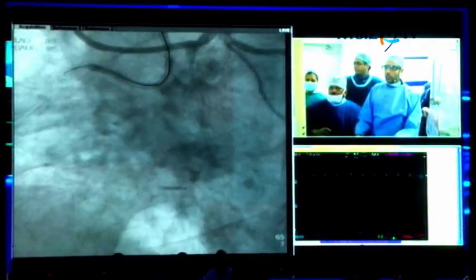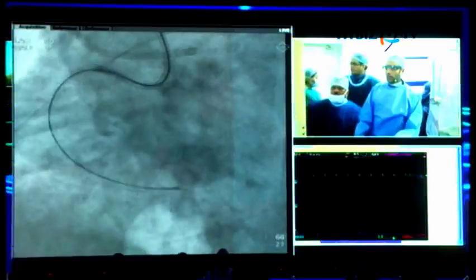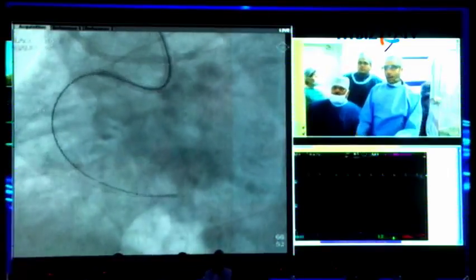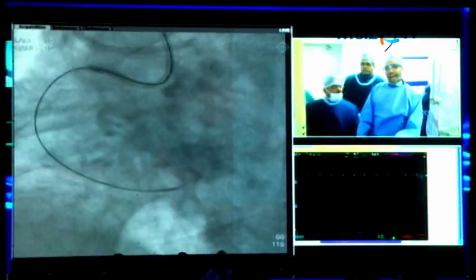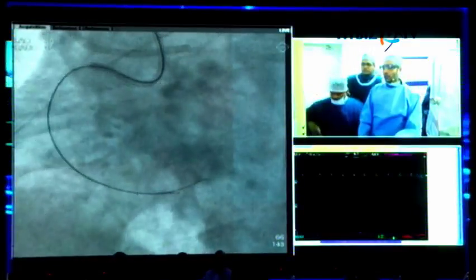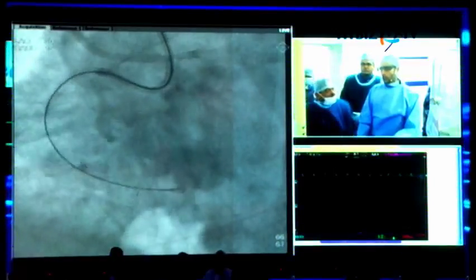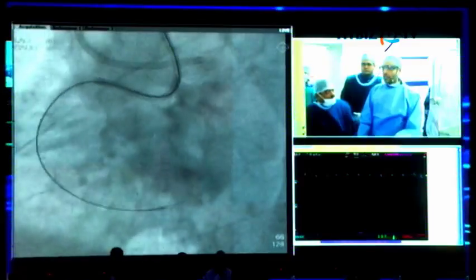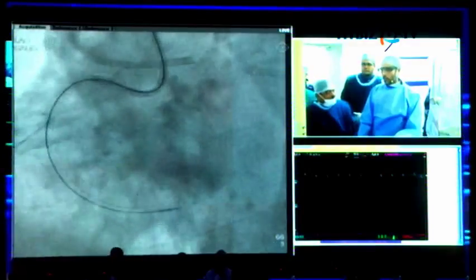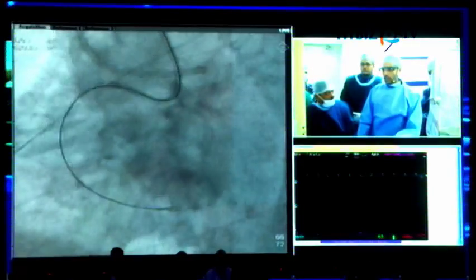So I think that's where we left you. Next. I just stored this, step by step. Which wire did you take? Okay, this is old school. I just did it. Honestly, don't do this. This is a bad teaching case. I apologize. I did stick and drive in a diseased vessel because I was desperate, and I've done this in the past. We will not learn everything from that. We will learn little from that.